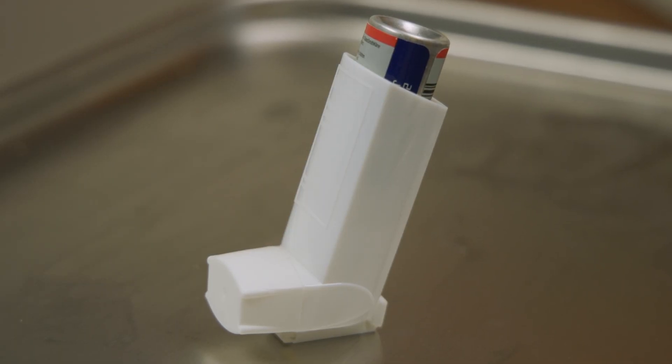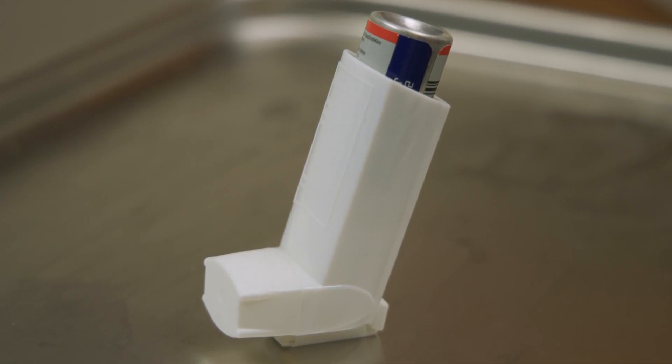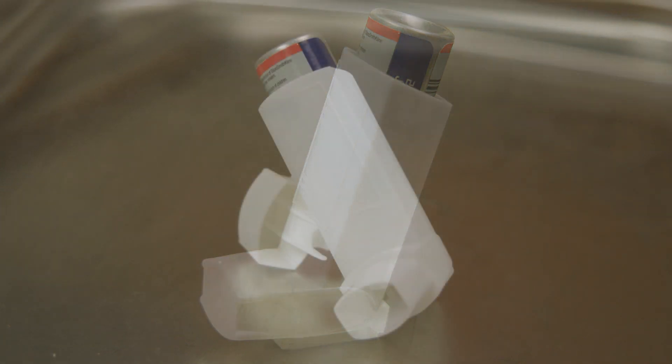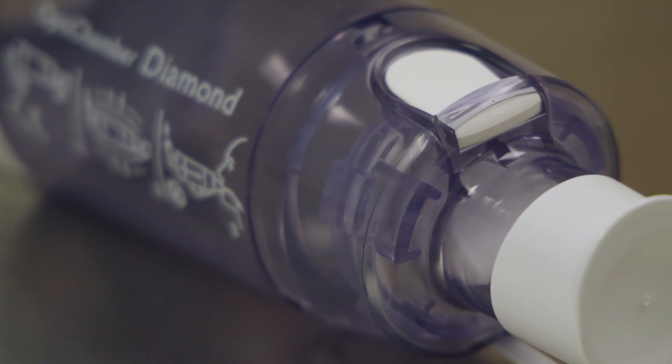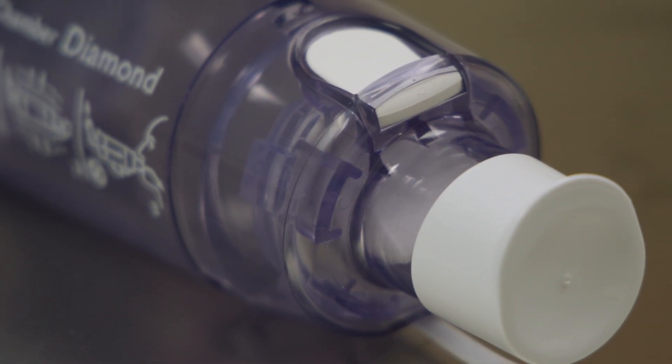This is a metered dose inhaler, or MDI. Medication from the MDI can only work if it is used correctly. The medicine in the canister is under pressure, and because of this, a spacer or holding chamber must always be used to administer the medication.